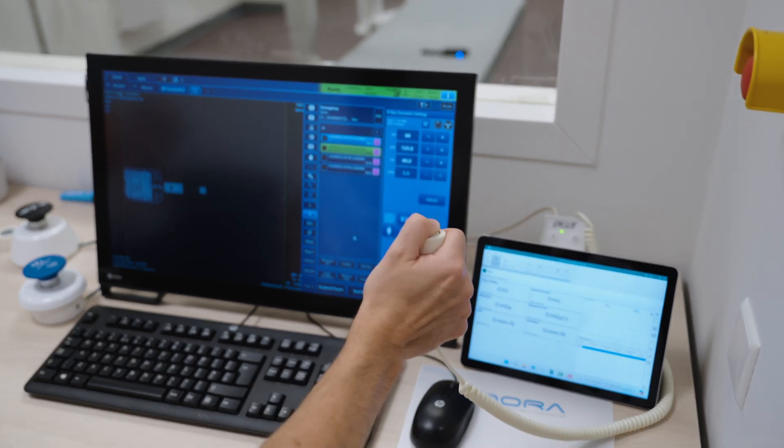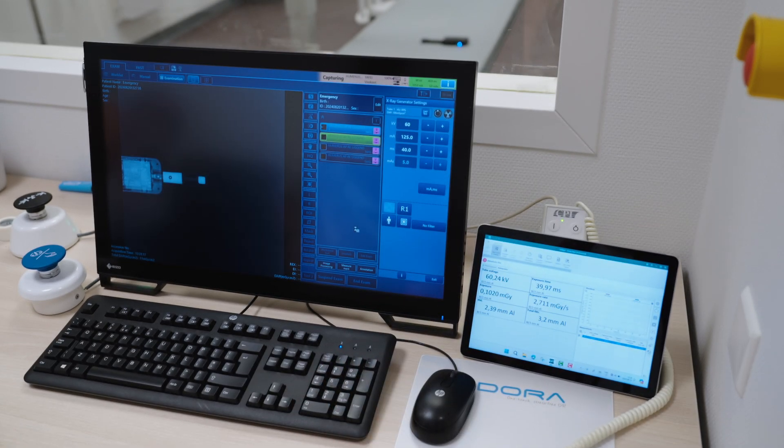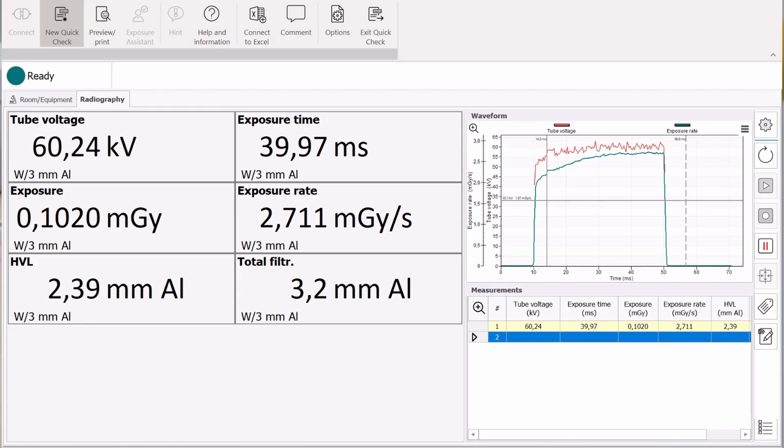Make an exposure on the x-ray system. Values for KV, dose, dose rate, exposure time, HVL and total filtration will be displayed automatically.